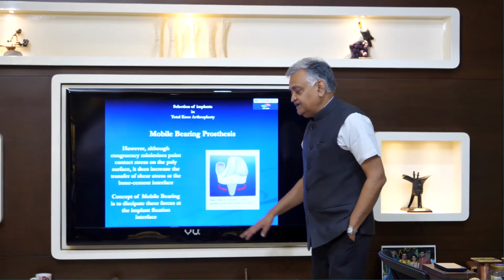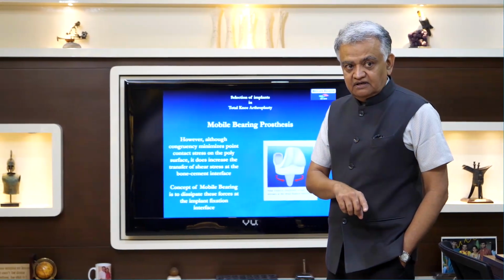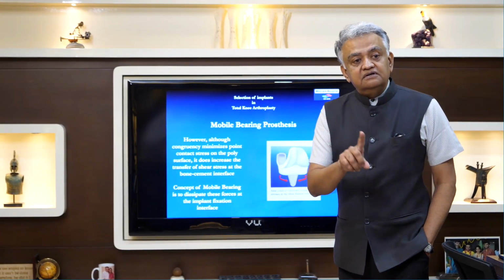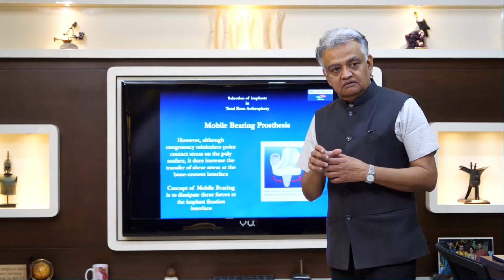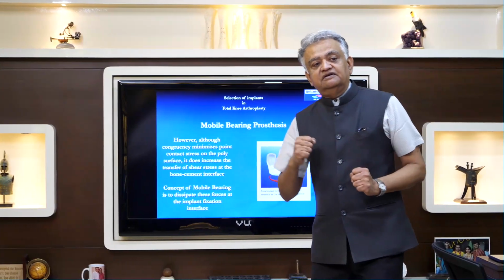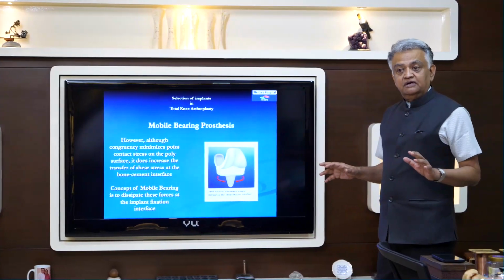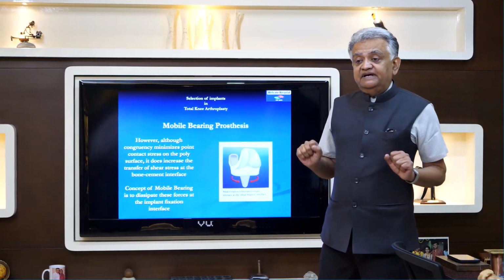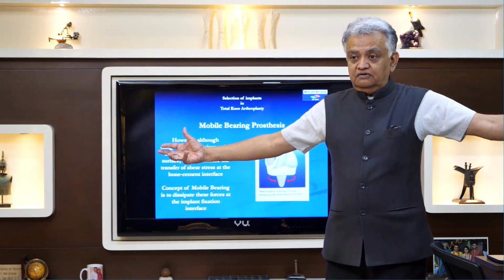So mobile bearing became a game changer. It allowed conformity without loosening of the implant and bone bonding, and also reduced the multi-directional wear. And that's why mobile bearing was a game changer. Why is it that despite that, mobile bearing did not occupy the vast majority of this?